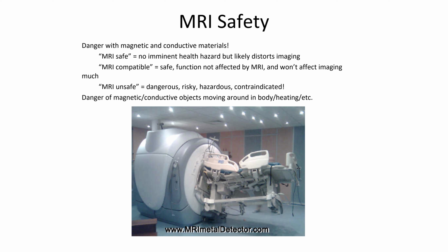It turns out if you just loop the wire around so that it makes a 360-degree curve, it will typically cancel out any current flow in one direction or the other. So that's a pretty simple solution. But devices have to be carefully recorded and documented, and FDA classifies them with all sorts of specific classifications. So it's good to be aware of those. And you can actually use specific MRI protocols to minimize the risk for people that have certain types of implants in their body.